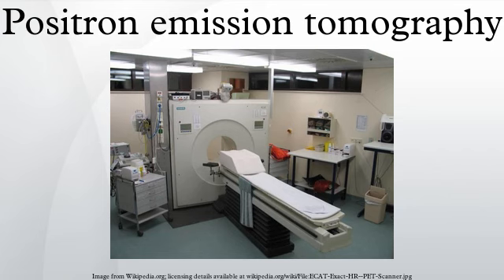Furthermore, most tissues cannot remove the phosphate added by hexokinase. This means that FDG is trapped in any cell that takes it up, until it decays, since phosphorylated sugars, due to their ionic charge, cannot exit from the cell. This results in intense radiolabeling of tissues with high glucose uptake, such as the brain, the liver, and most cancers.